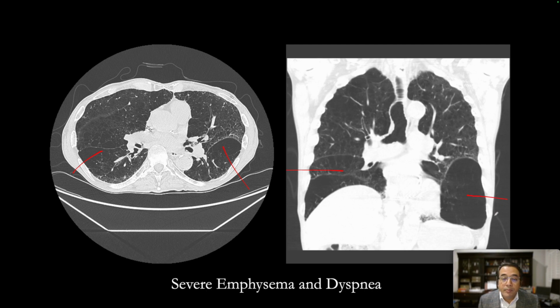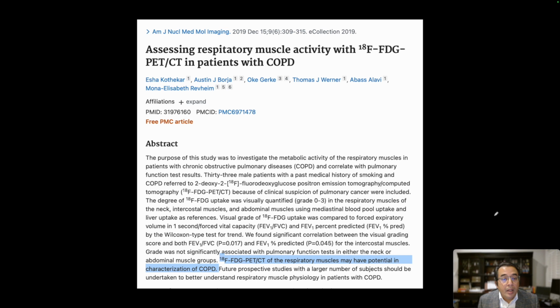And this is an article related to this topic, where authors say that FDG PET-CT of the respiratory muscles may have a potential in characterization of COPD.